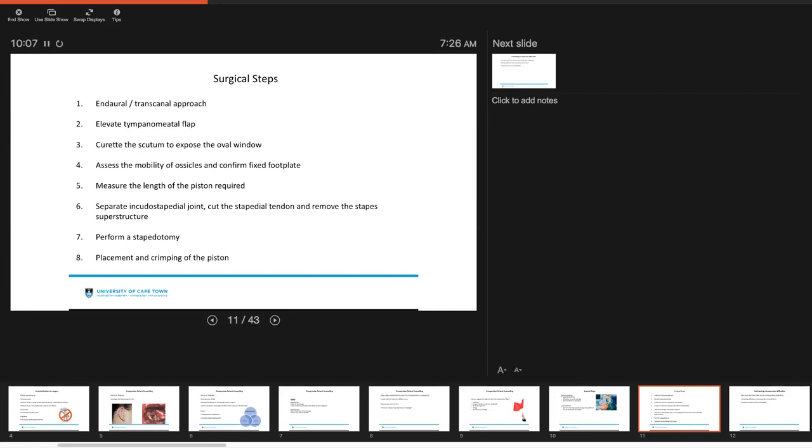You'll then perform a stapedotomy. There are various ways to do this, either laser or others, and then you want to place and crimp the piston. This is obviously very simply put, and there are variations of these surgical steps.